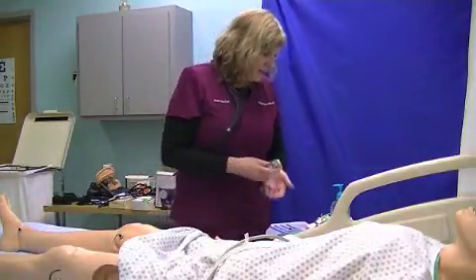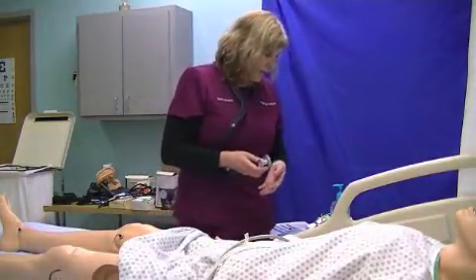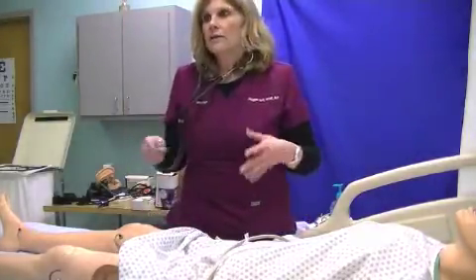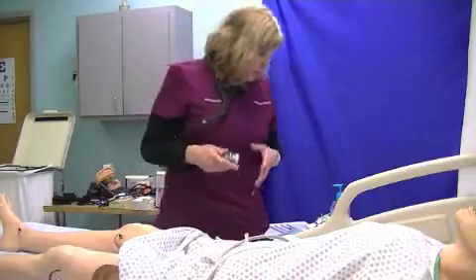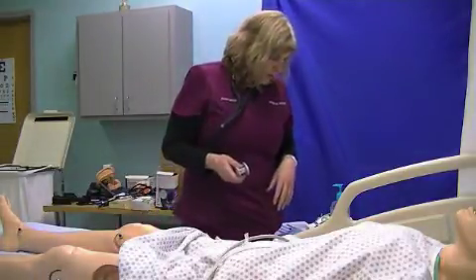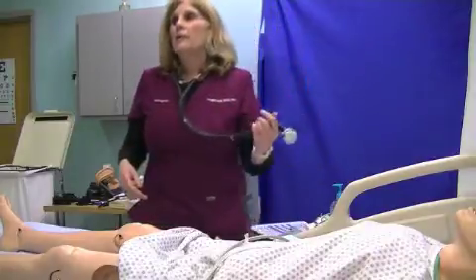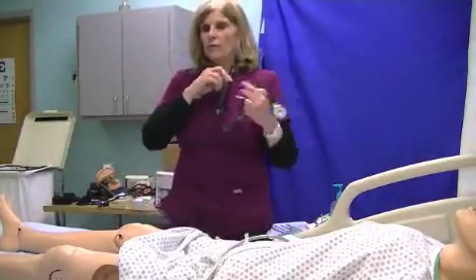So we already cleaned the stethoscope, and we warmed it for 10 seconds. You want to make sure it's not too cold because it can cause the heart rate to slow down, because of vessel constriction. We're going to look for what we call the point of maximal impulse. Now, how do you find the point of maximal impulse?